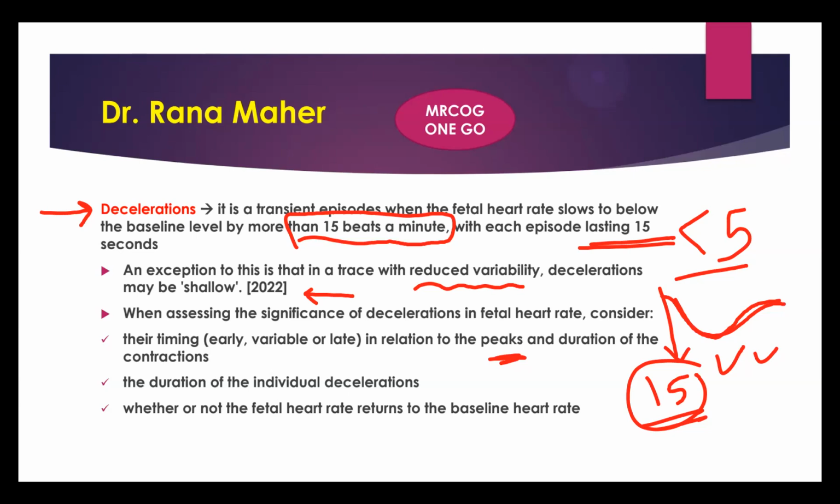So what about the early decelerations? What about the cause? Can anyone answer this question? Head compression. Head compression. Very well done, Manikam. And what about the variable?